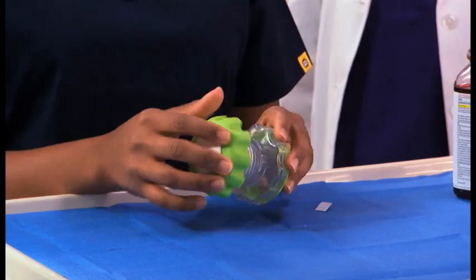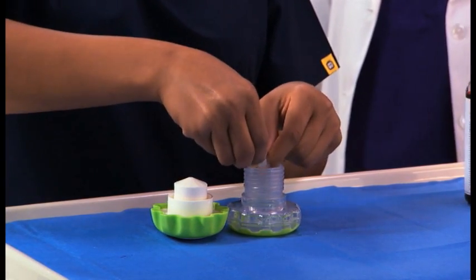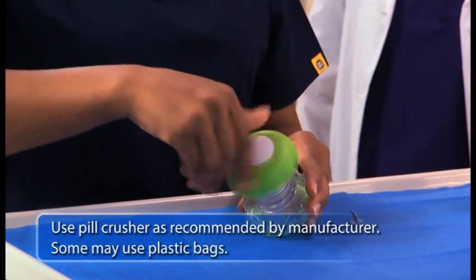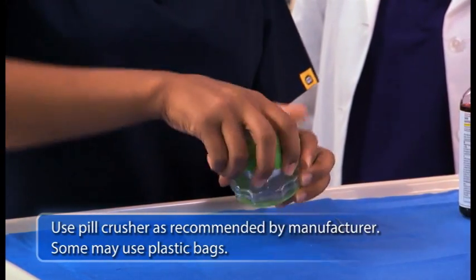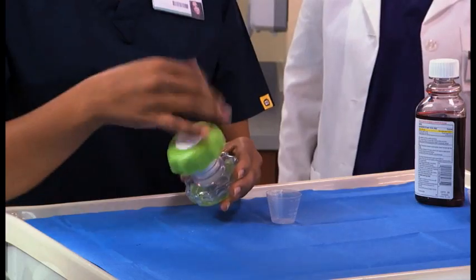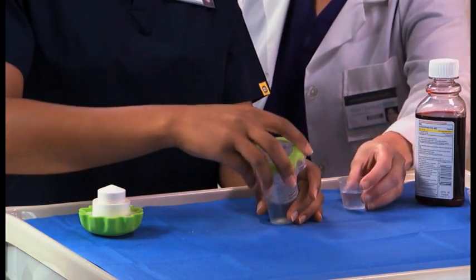Correct. So grab the pill crusher. Remove the tablet from the package. Place the tablet in the crusher and crush it. Okay, the tablet is ground. Now I dissolve in water, right? Yes, pour the powder into a plastic medication cup and dissolve in a small amount of water.